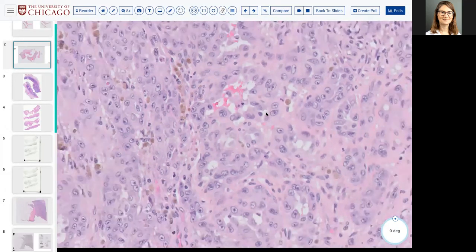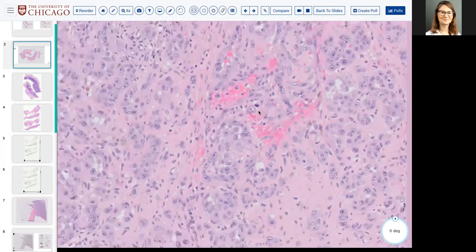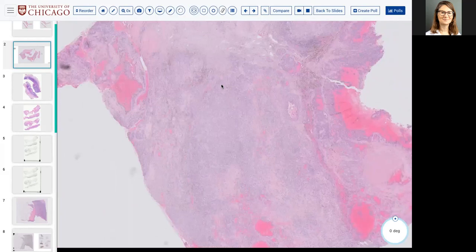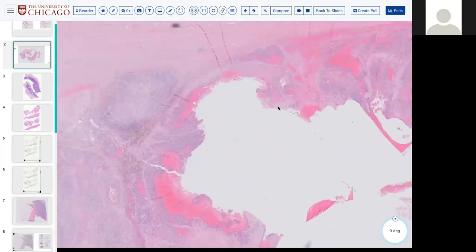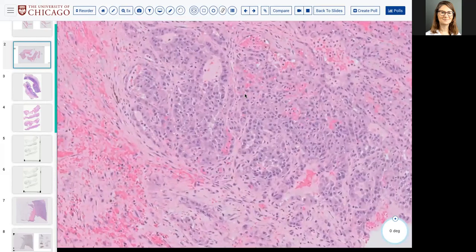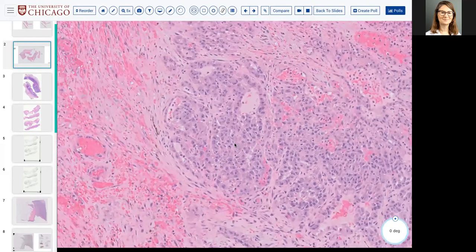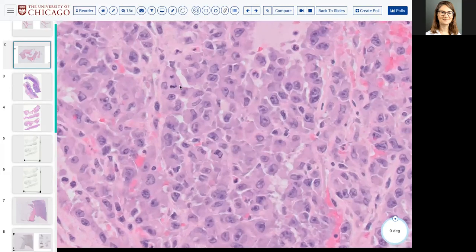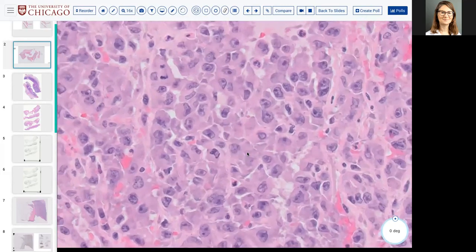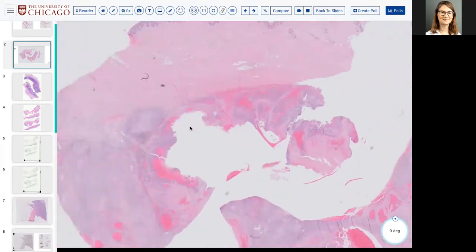in the lumen. So the crazy thing is that your differential is exactly between an epithelioid angiosarcoma and an epithelioid hemangioma, because hemangioendotheliomas really should not be vasoformative. So once you have true vasoformation, you are now dealing with something either completely benign or completely malignant in most cases. That's my gentle rule of thumb for these. And when it's this large, when you see mitoses, this many prominent nucleoli, peripheral infiltration, I think you can favor, like you said, an angiosarcoma.